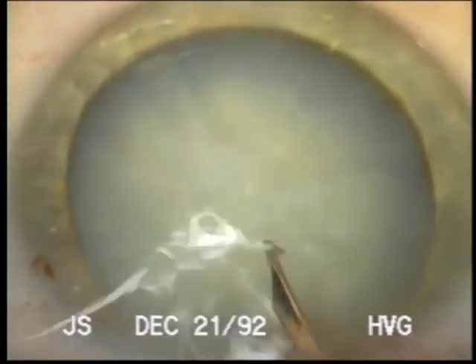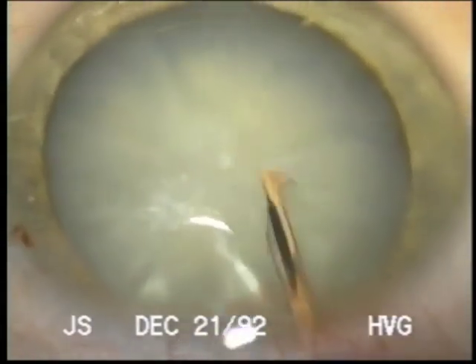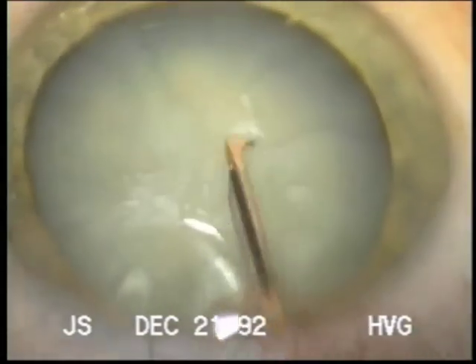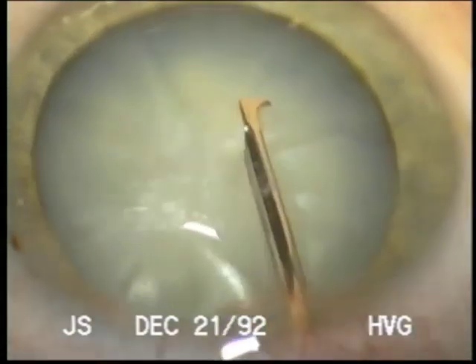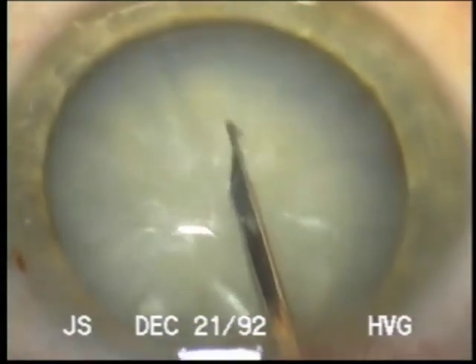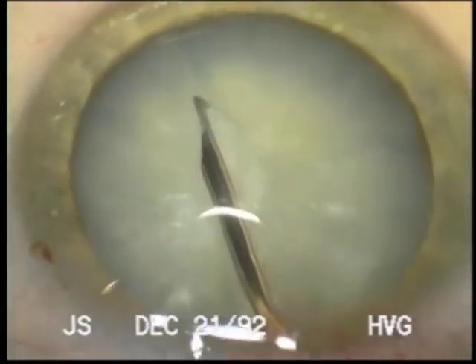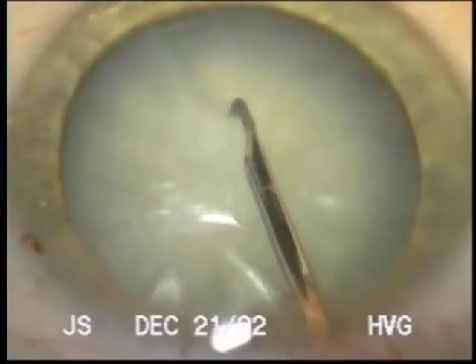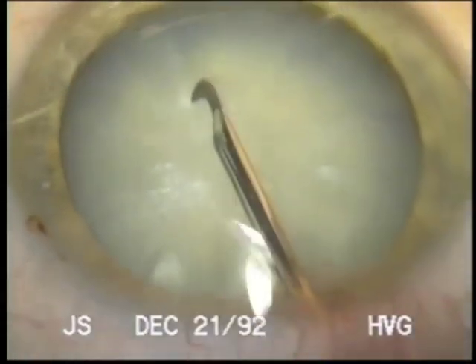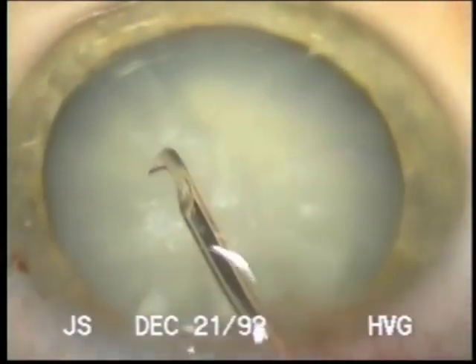So I make a very small can opener capsule for good control, and once I'm sure that I have a can opener I'm just enlarging it a little now. If we can get these definite snips with a dull cystotome, they are fairly resistant to tearing further.